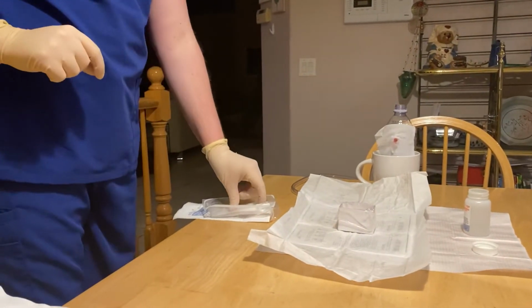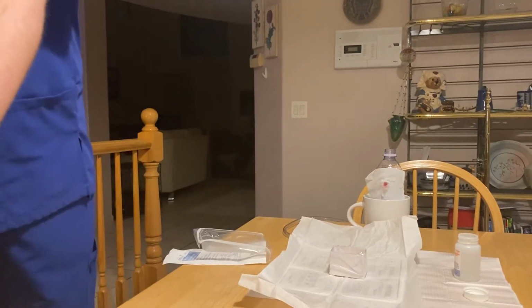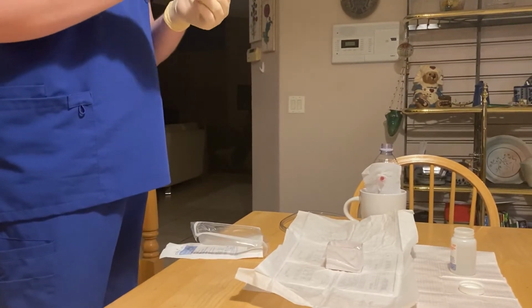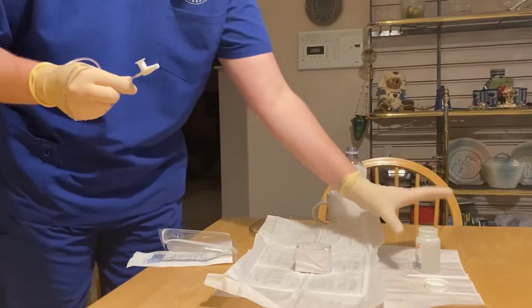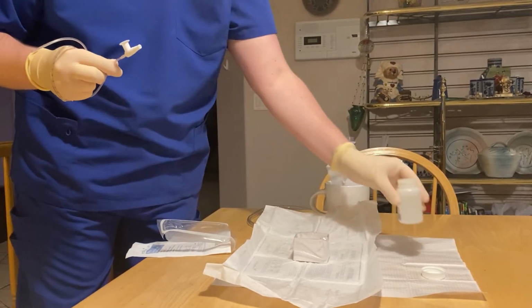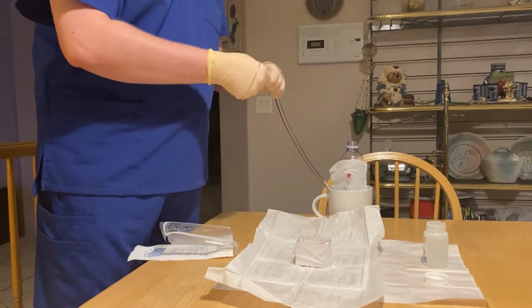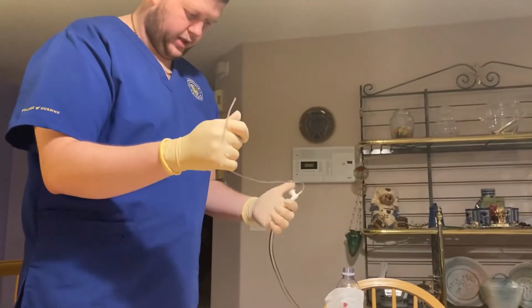Then I would remove my suction tube and throw that part away. I would then wrap this part around my dominant hand to make sure it stays clean. After that, I'm going to dirty one hand. So I would take this and pour my sterile saline in. After I poured my sterile saline in, I would take out this and plug it in here. And this is still clean, and then this is dirty.